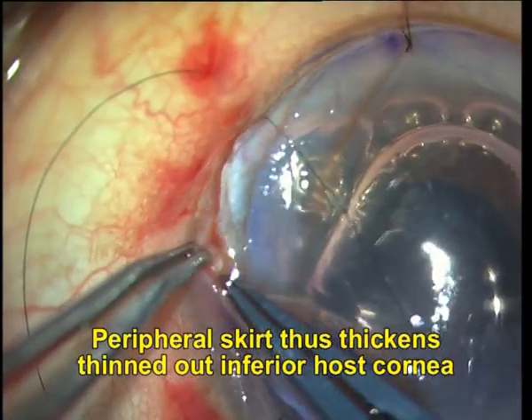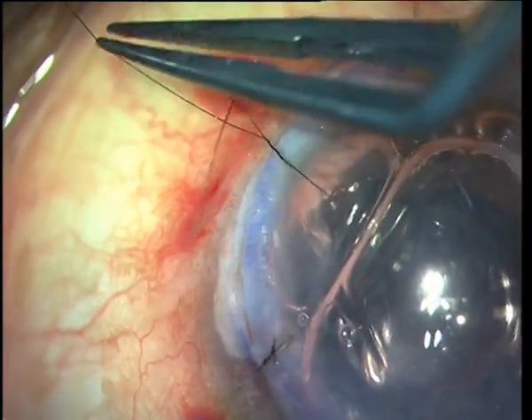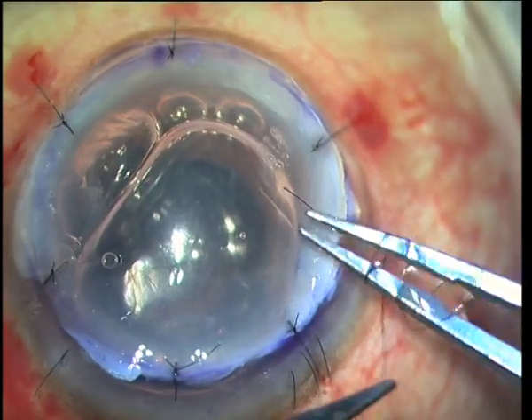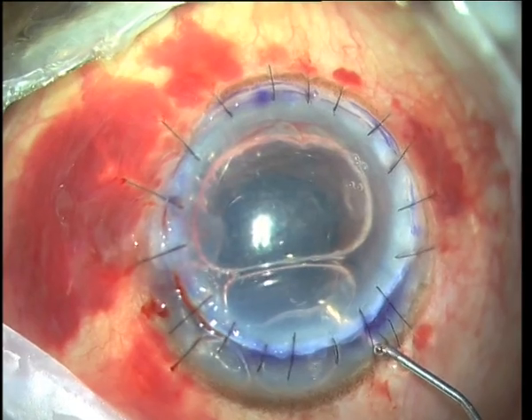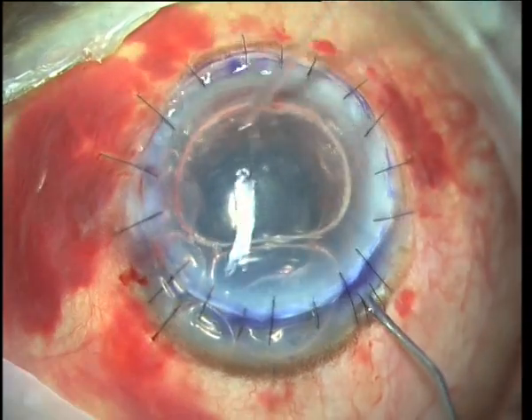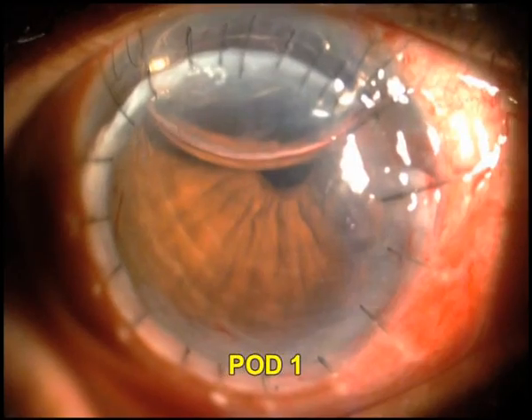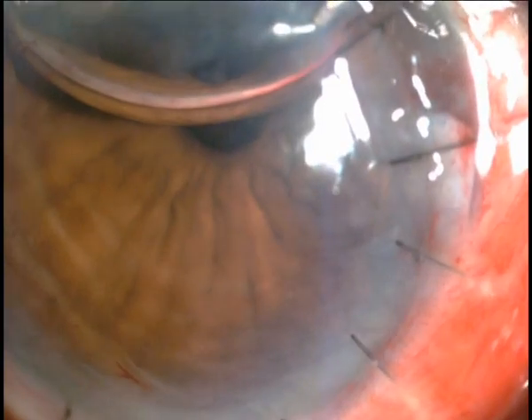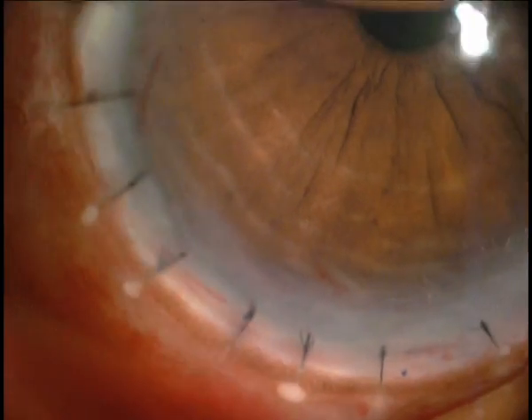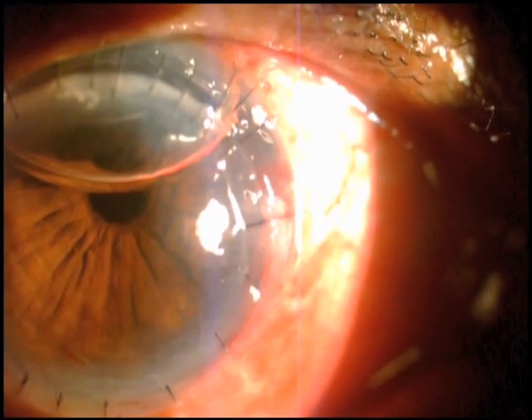The peripheral skirt thus thickens the peripheral host stromal thickness, and we know that this is the problem in pellucid marginal degeneration — this is exactly what we are trying to take care of. Once the entire suturing has been done, I inject air into the anterior chamber. You can see the first post-operative day appearance: the Descemet's membrane is well attached to the graft, the eye looks quiet, the pupil is round, the IOL is in place, and the air bubble is still present though mostly absorbed.